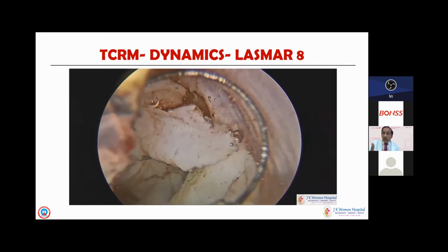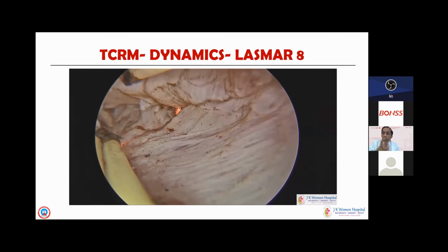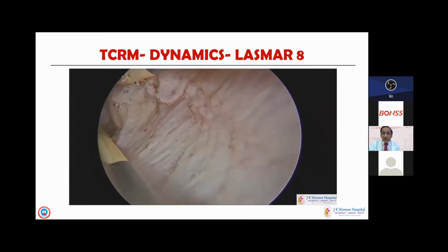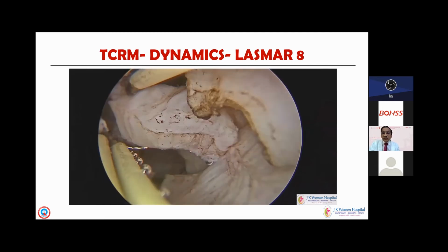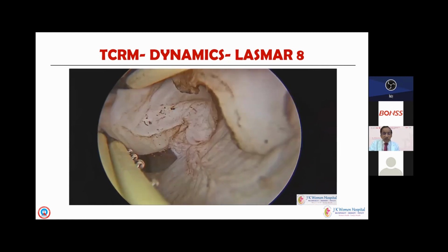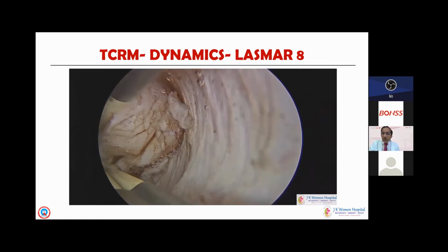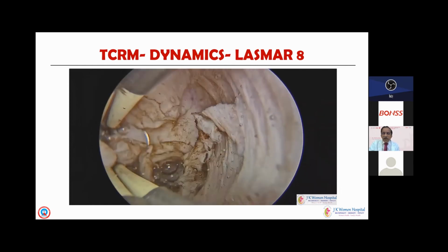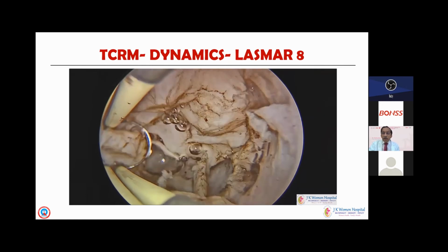But today, for type 1 and other fibroids, we have found the way of cold loop myomectomy described by Mazzoni et al., where you might enter into the pseudocapsule, subcapsular, by dissecting with a grasper and dislodging the myoma from the intramural bed and just leaving it in the cavity, for it to fall out after a couple of weeks. So of course, it is a matter of time for us to learn all those cold loop myomectomies, but you cannot use it in every case.